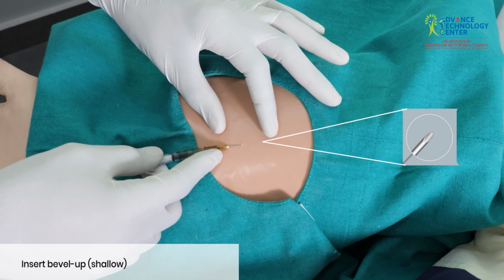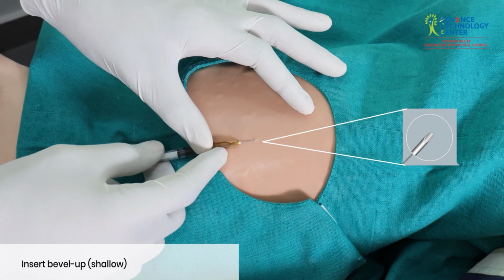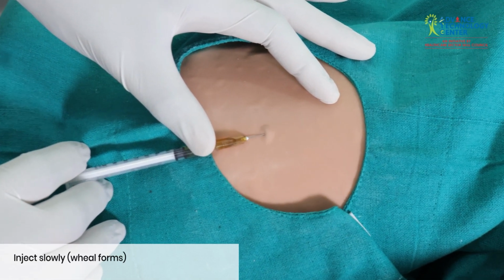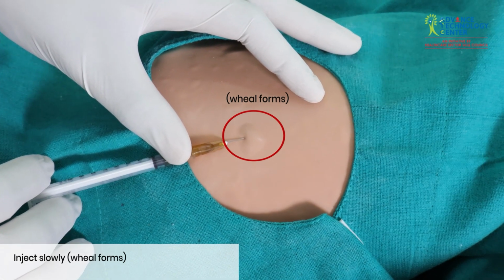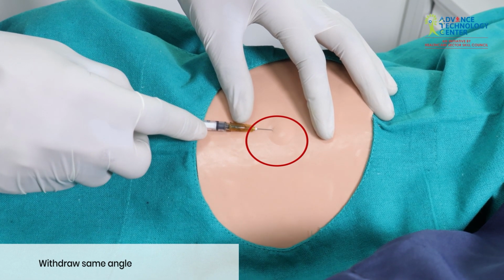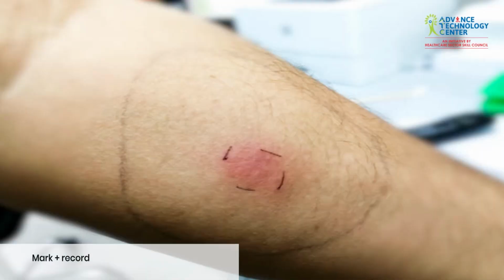Insert the needle bevel up very shallowly into the dermis, approximately 1/8 of an inch, so the tip remains within the skin layer. Inject the medication slowly and steadily, watching for a small raised wheal or bleb, which confirms correct intradermal placement. Withdraw the needle gently at the same angle used for insertion, taking care not to rub or press the site. Mark the injection site with a pen and document the date and time so the reaction can be checked accurately during follow-up.